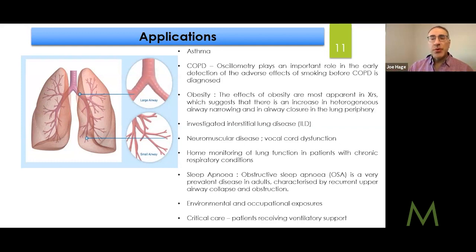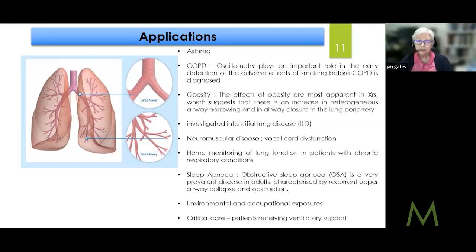if you were to mass produce this, you need to ship it. What packaging tests, drop tests and the like? Jan, you're going to have the stage, I think. We have done IEC drop test, 1 meter drop test, all that we have done. Is that what the question is? Yeah, that's what she's asking, I think. Okay. Yeah, and vibration and everything else that goes with it.